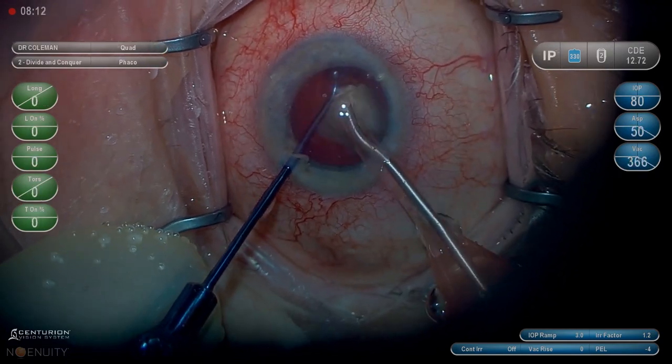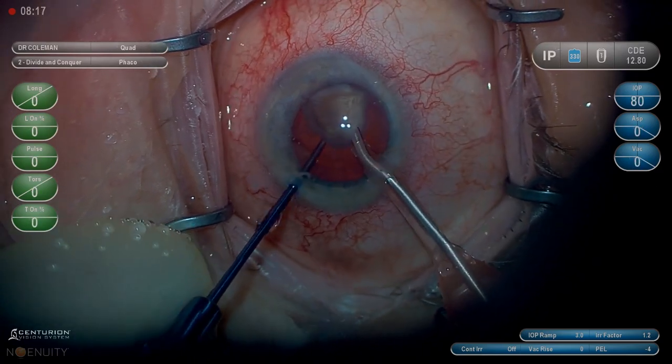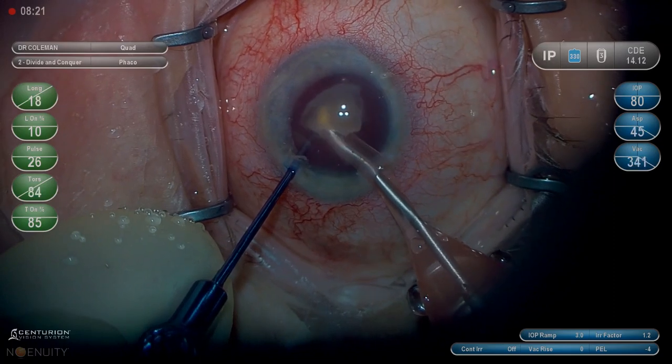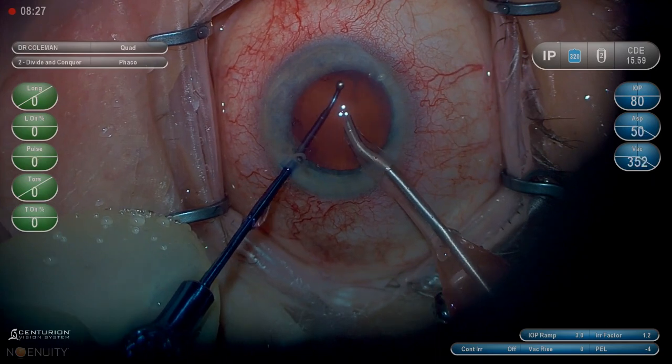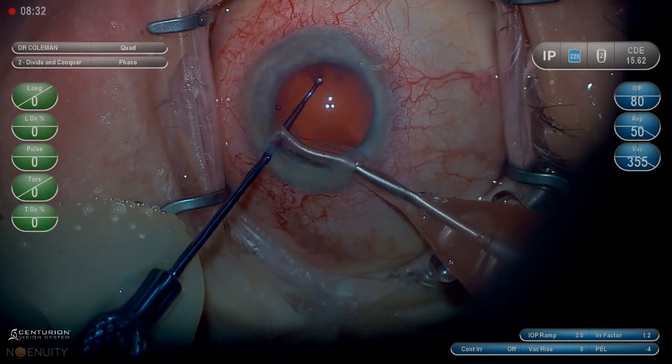You can see this is a very dense lens even with the miLOOP — the CDE is getting up around 16 before the case is done. You can safely say that without the miLOOP it would be in the 20s at least. I believe the miLOOP probably takes about five off of your CDE on any given case with a very dense lens.